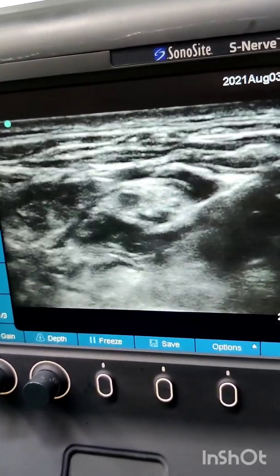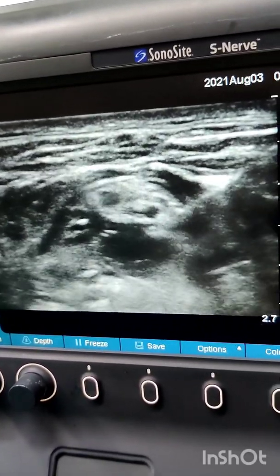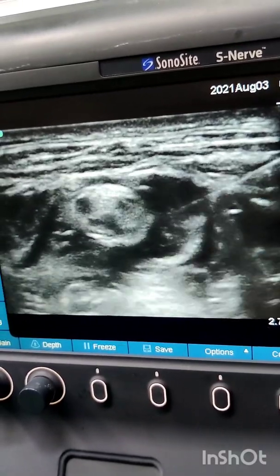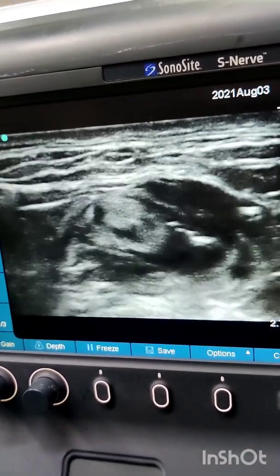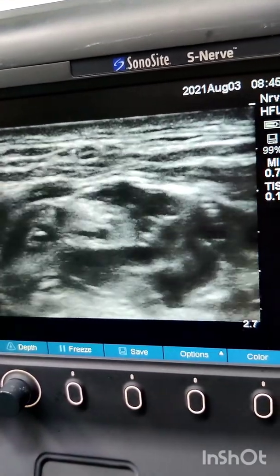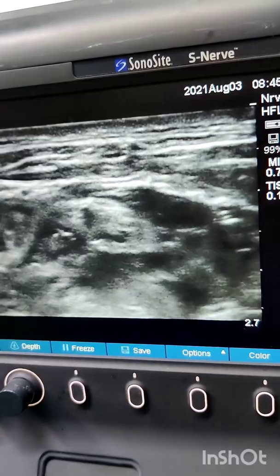The second injection is in the pocket between the subclavian artery, brachial plexus and the first rib. Inject another 10 ml of local anesthetic drug here and you will see the brachial plexus getting lifted above the first rib. The drug surrounding the plexus gives a donut-like image.